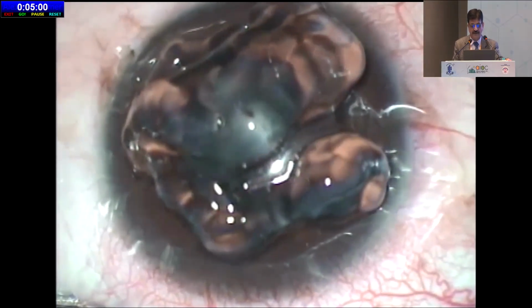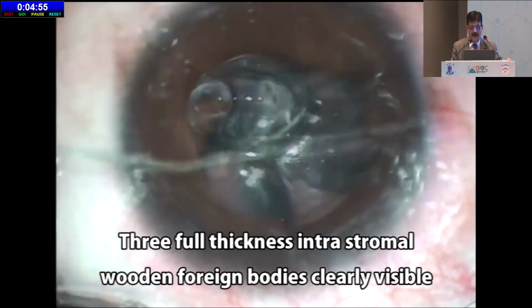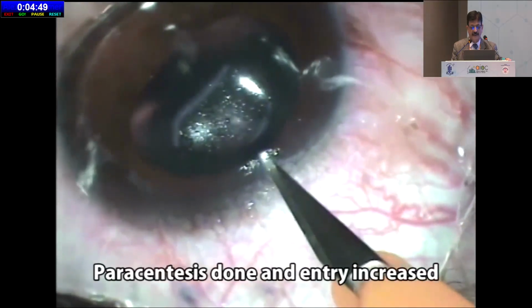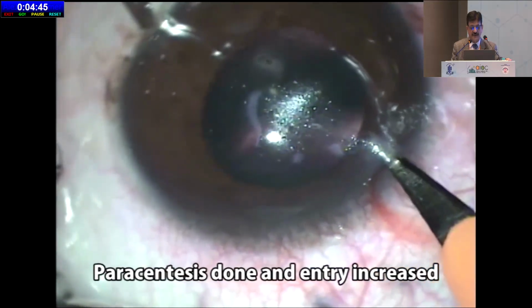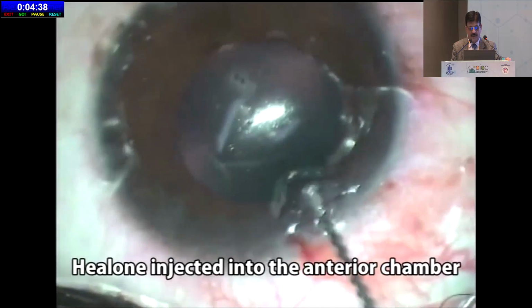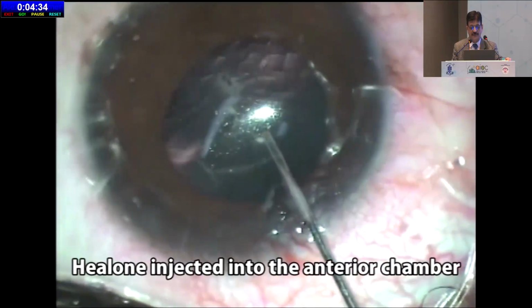The next case you will see is more challenging. We have a young patient who again fell on a bush, and he had 3 vertically oriented wooden foreign bodies, and they went up to deep stroma. There was no way to remove them externally, so we thought we'll go for a combined approach for these corneal foreign bodies. We had at that time no special instrument designed for it, but we can also design it.